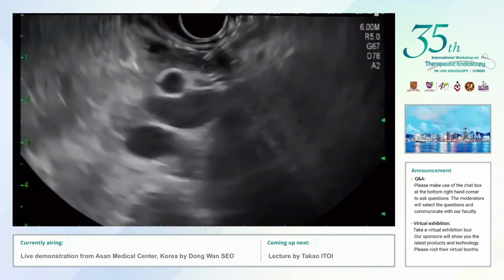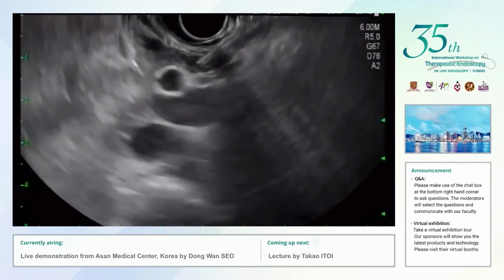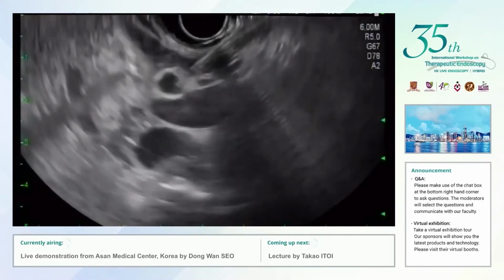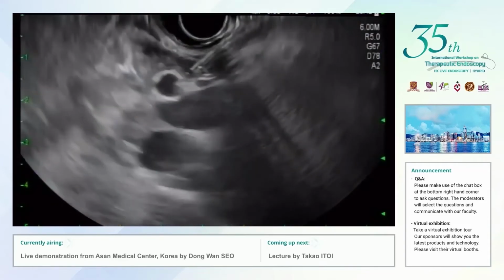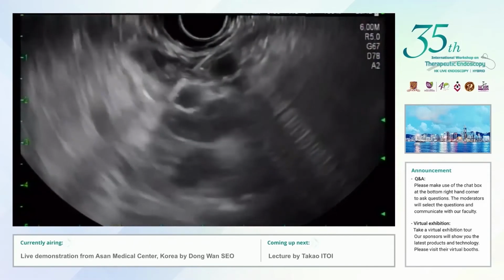Or genetic analysis, or I think there is some mucinous material, so we can get some amount of fluid, but there is stickiness, and slowly the fluid is coming. So it is definitely a mucinous lesion, not a serous one.